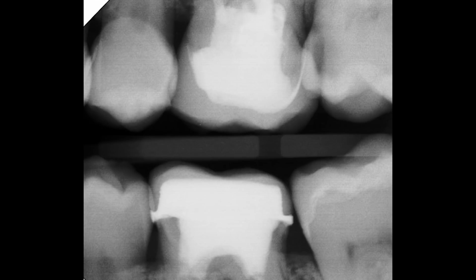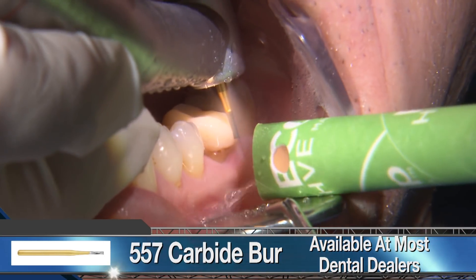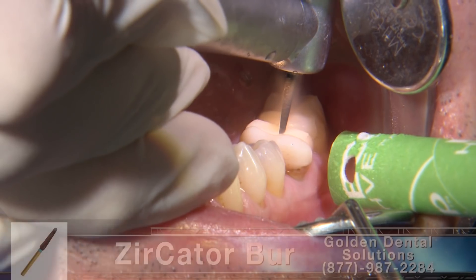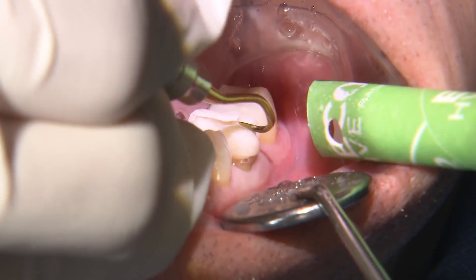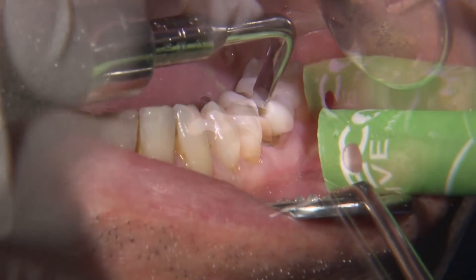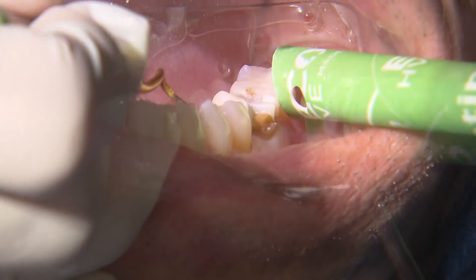Based on the pre-op radiograph, I initially thought number 19 was a porcelain fused to zirconia crown because of the radio opacity near the margins and the core. So I began the removal with a 557 carbide, as I usually do for feldspathic porcelain, but it was really difficult to cut through. Switching to a ZirCator diamond bur made the sectioning a bit easier. Realizing now we have a bonded ceramic restoration, I needed to make several sectional cuts through the crown to separate it off the prep.